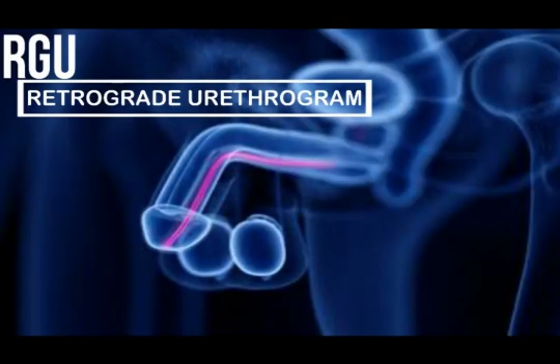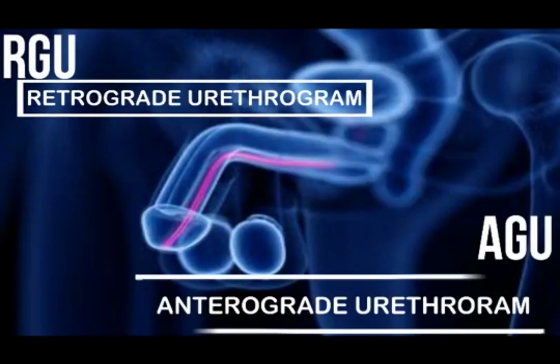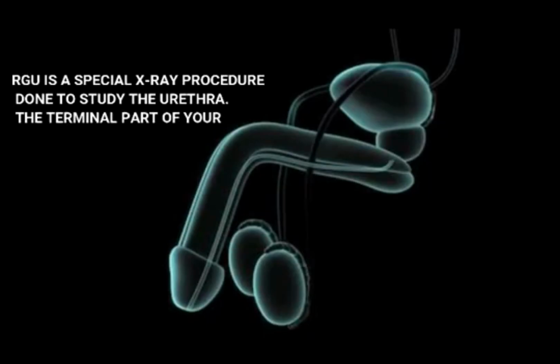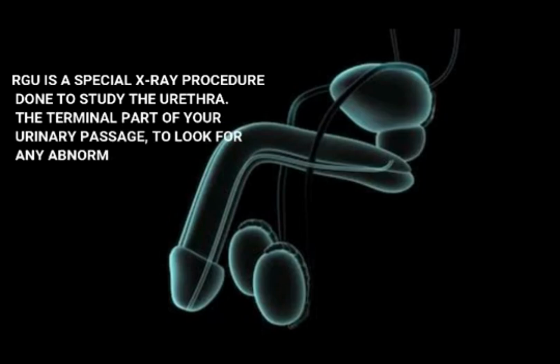Today's topic is RGU, retrograde urethrogram, and AGU, anterograde urethrogram. RGU is a special X-ray procedure done to study the urethra, the terminal part of your urinary passage, to look for any abnormalities. It is usually done in males.